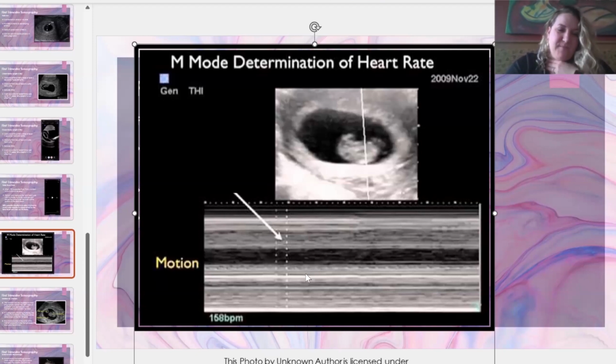What I mentioned on my slide that I think your question is about, the very important part of measuring here, is that if you pick, let's use one of these over here. So see how we have 1, 2, 3, 4 beats like this.